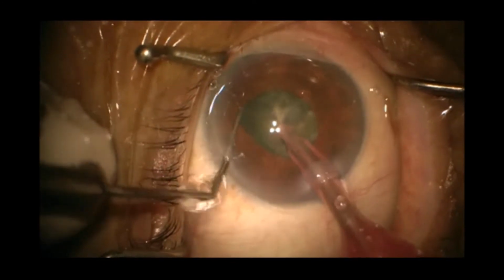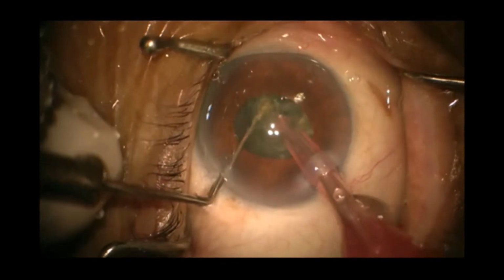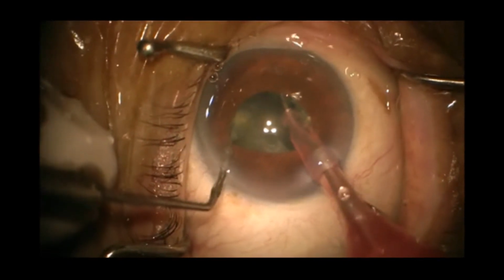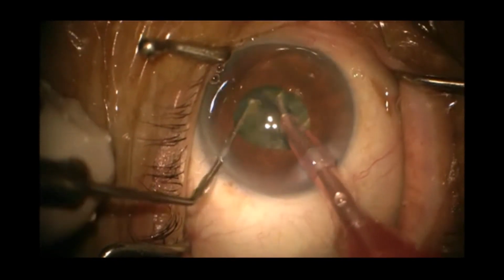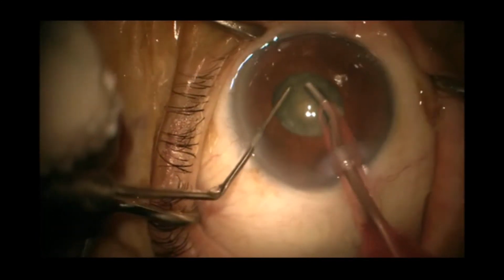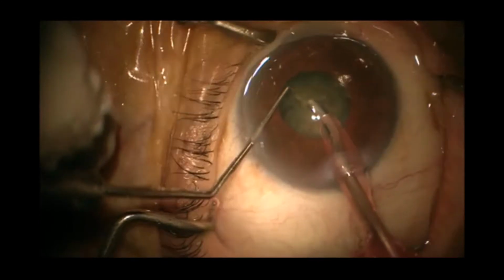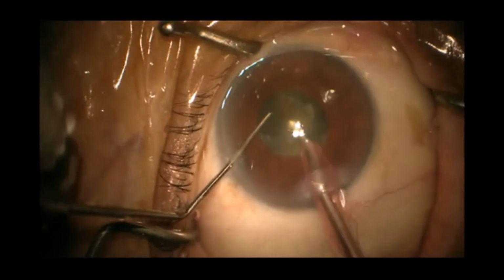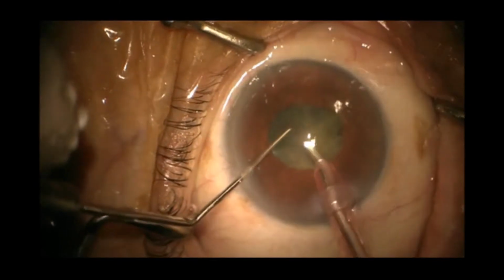The aim is to have at least 4 to 5 nuclear pieces. Now we have achieved a complete crack over this side. And I am able to mobilize a free quadrant here.